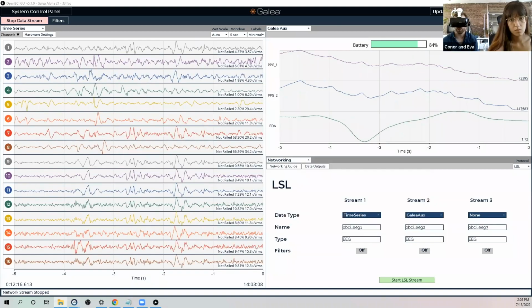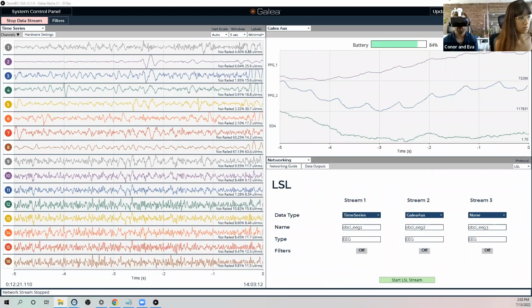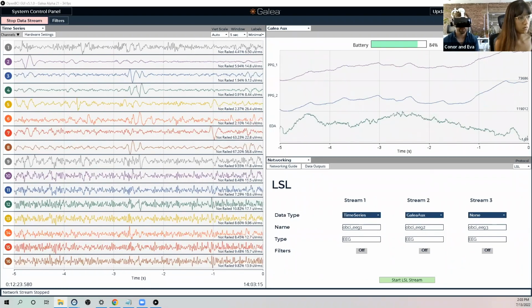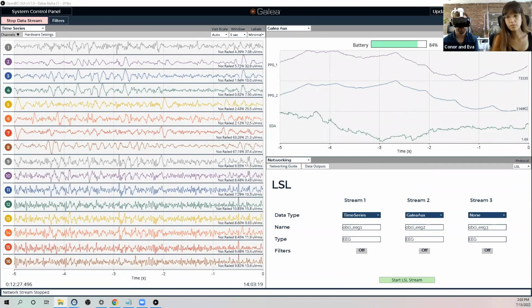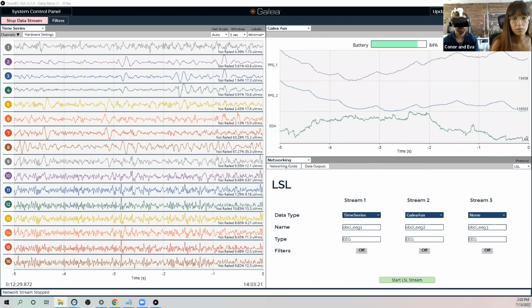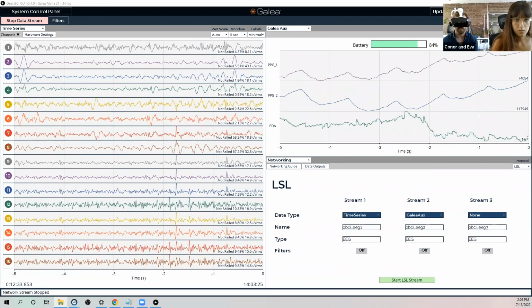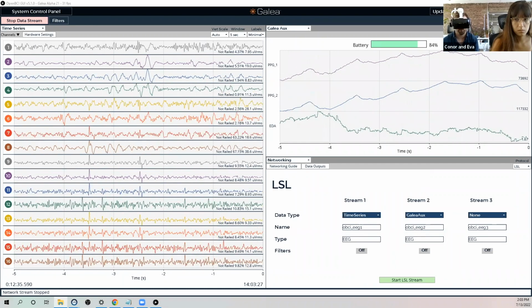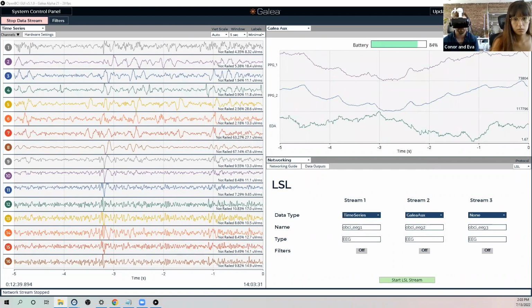Sure. So I think you started to answer this question before we got cut off, but thus far, we have tested the alpha units on everybody at the company, and so we've gotten 15 or so different heads into Galea with the ability to collect good data from everybody. We have taken alpha devices to Augmented World Expo, and then also a press event last week, and we've put the devices on additional people.